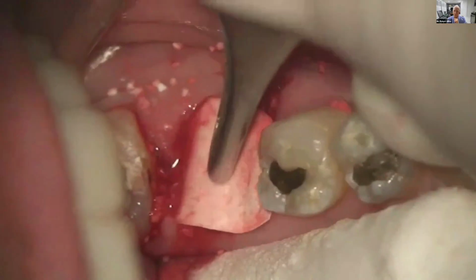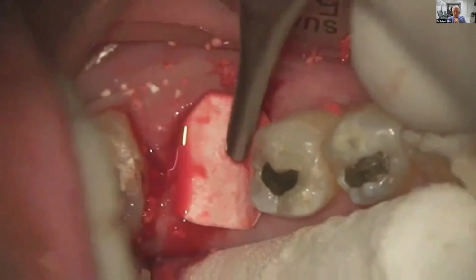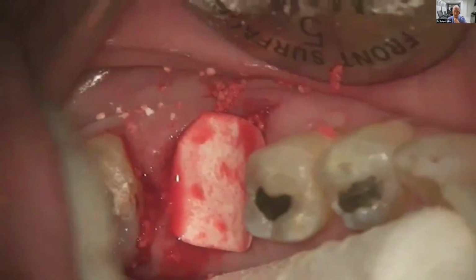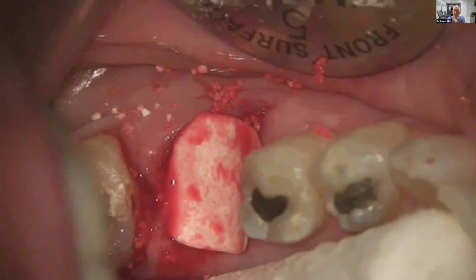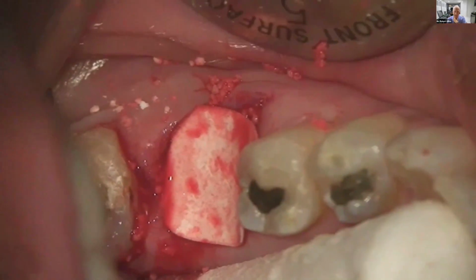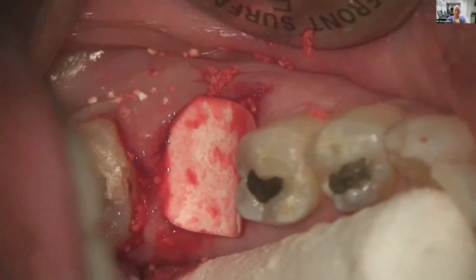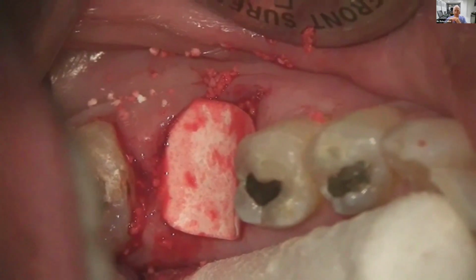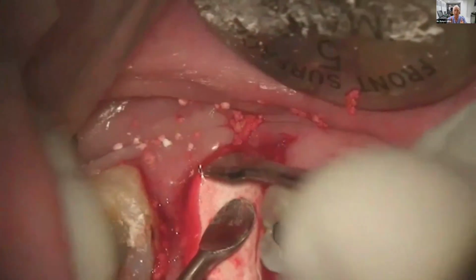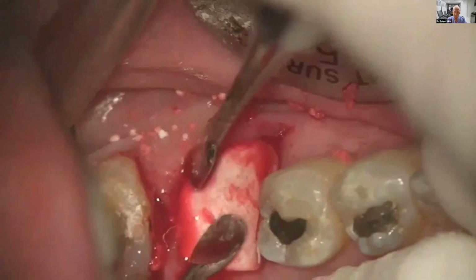We must use a collagen membrane. And we cut it to be about 2 millimeters or so larger than the defect. Then we place it over the graft material, and we tuck the margins underneath the flap circumferentially. And then with a very careful suture technique, with a mattress suture technique, we suture over the top of it, either an X over the center or 2 railroad ties or a combination so that the membrane doesn't come out prematurely and you protect the graft.